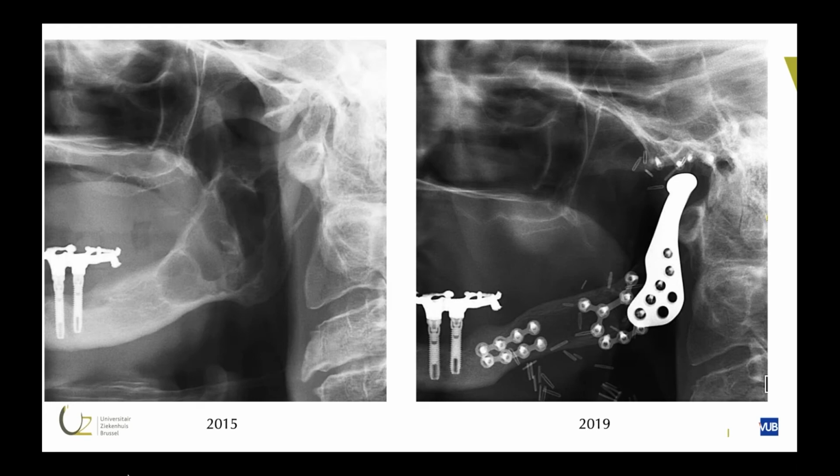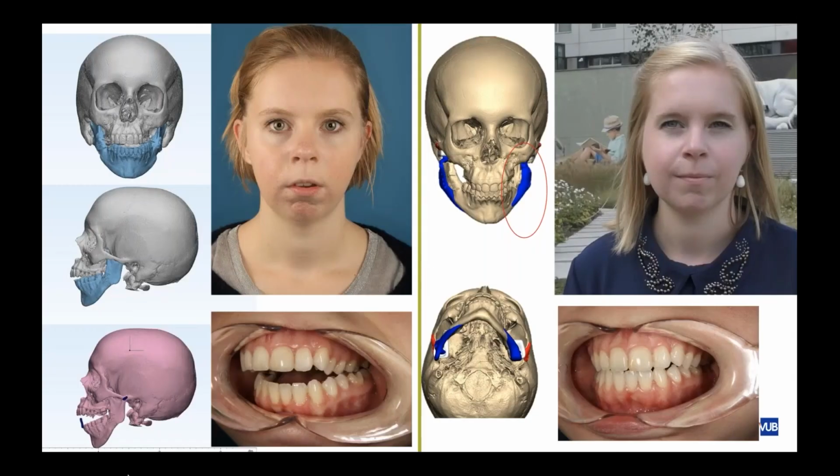I used a stock TMJ prosthesis to avoid bony ankylosis in the TMJ. But today, I would reconstruct it all using an extended alloplastic TMJ prosthesis. It saves many hours of surgery and excludes the risk of flap failure. Today, I would keep the fibula as a backup, as a rescue procedure.